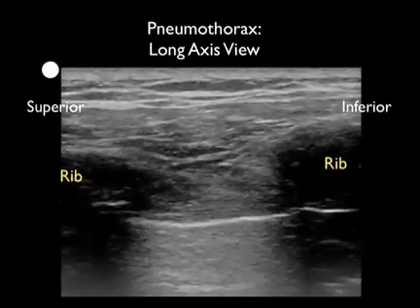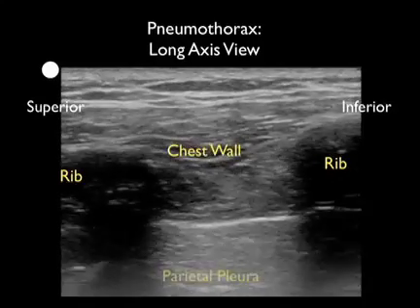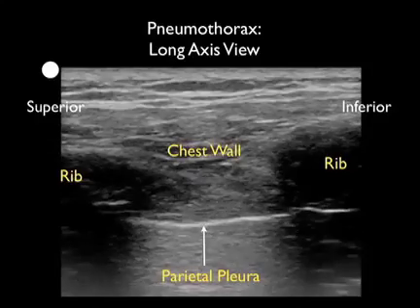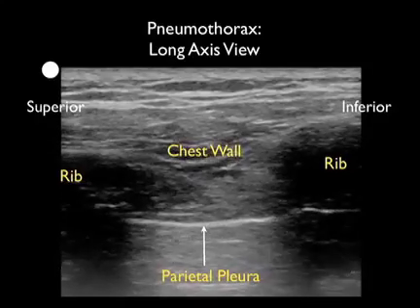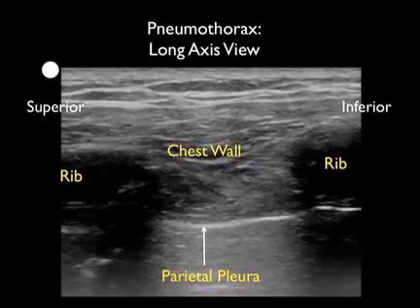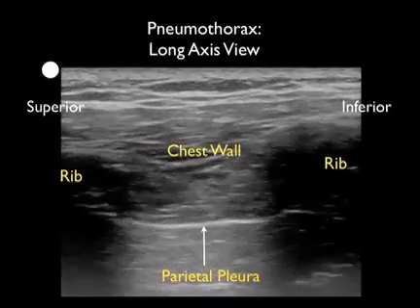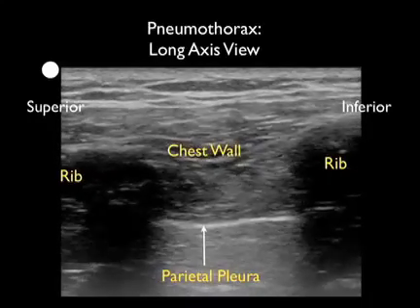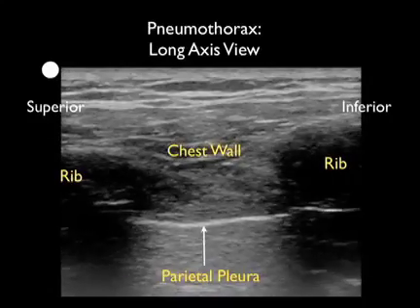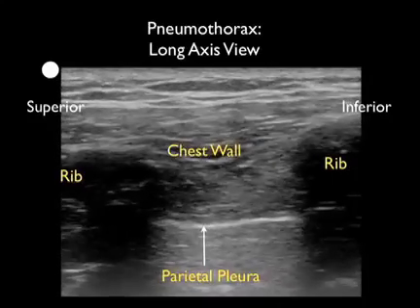Here's another image of a pneumothorax in a long axis configuration. We see here the chest wall anteriorly and the single white line which is the parietal pleura. Now this patient was acutely dyspneic, so notice that there is some motion of the chest wall and that the parietal pleura moves up and down, but notice the failure of horizontal sliding. Notice also the absence of any vertical comet tails coming off the back of the pleura.